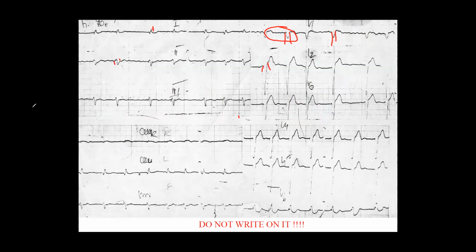What does it mean? It's an intraventricular block. Yes. And how do I check again, like how, if it's the right or the left side?